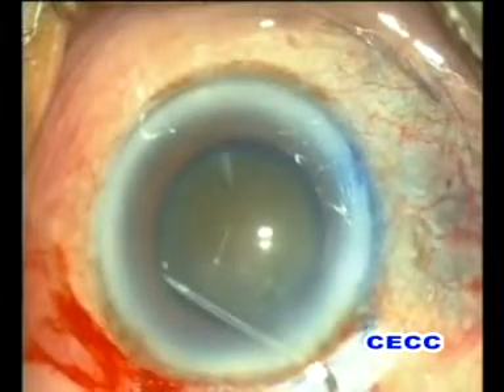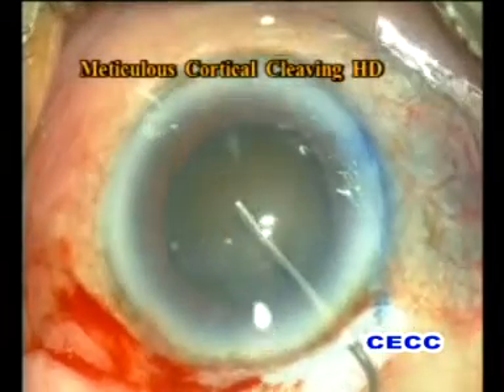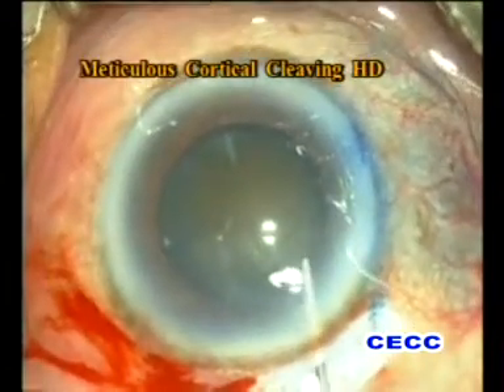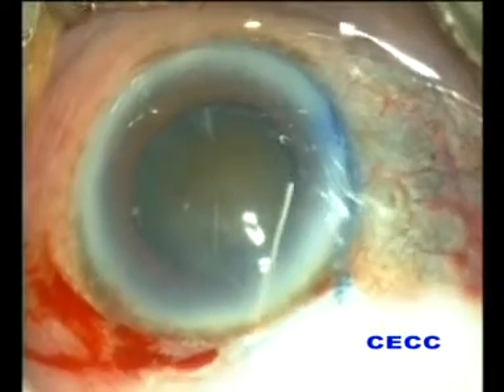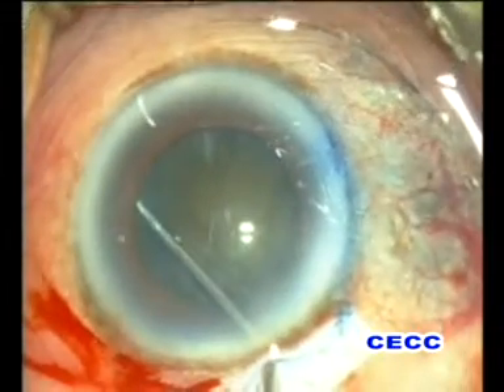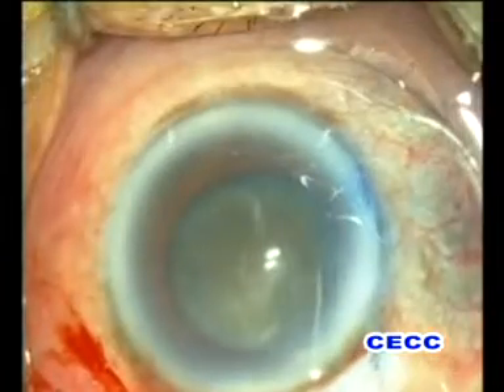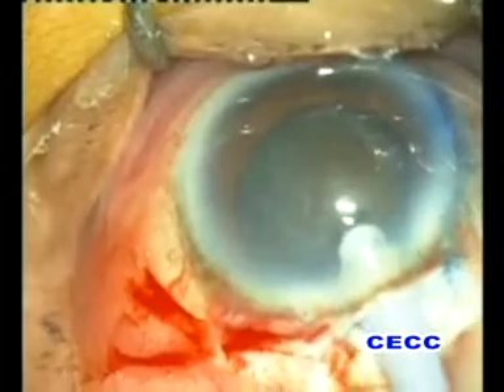Meticulous and complete cortical cleaving hydrodissection is of utmost importance in situations like this with strong capsulocortical adhesions. Cortical cleaving hydrodissection is performed at multiple points. The nucleus should never be rotated prior to complete lysis of the adhesions. In this case the nucleus seems to rotate freely.